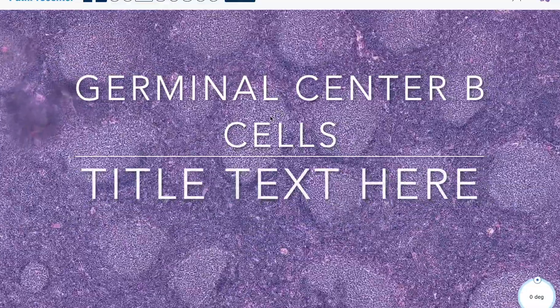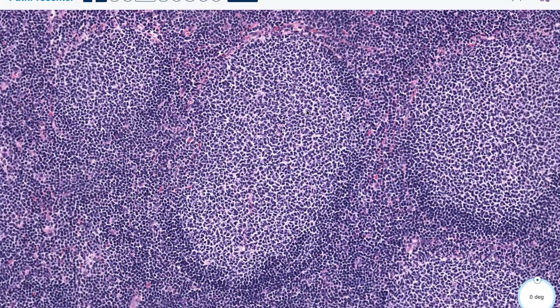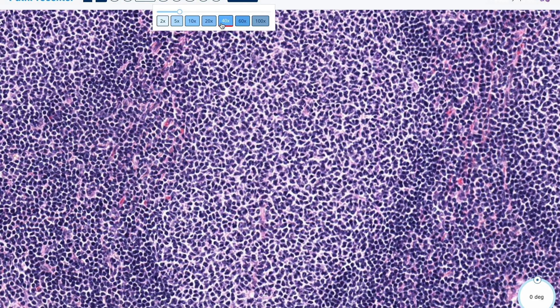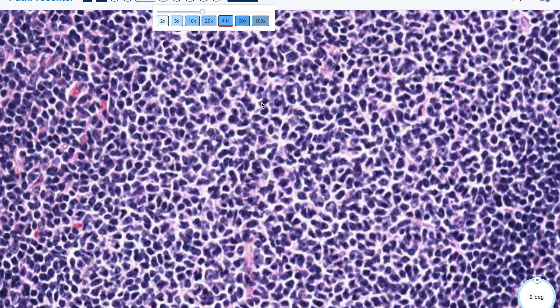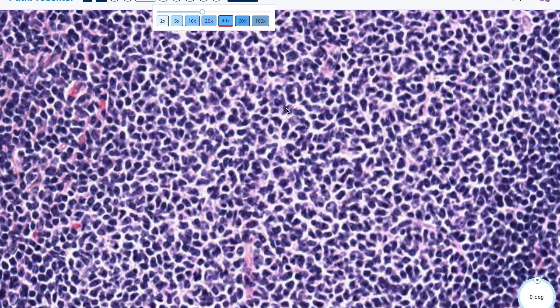In follicular lymphoma, going down to high power on one of these follicles, you're going to see two different cell types in varying proportions. You're going to see small cleaved cells, or centrocytes, which you can appreciate here with this cleaved pattern. And then you're also going to see some larger cells, which are centroblasts with nucleoli.